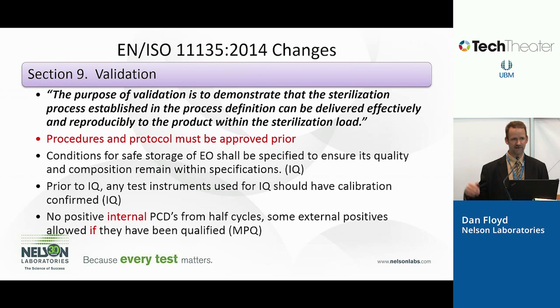Section 9 then, that whole section deals with validation. This is kind of a no-brainer, but they put this in as a clarification that the protocol and procedures must be approved prior to starting your validation. I don't know that anyone that's ever done a validation hasn't had their protocol approved ahead of time, but they felt the need to put that in there and highlight that. Again, more safety on that.